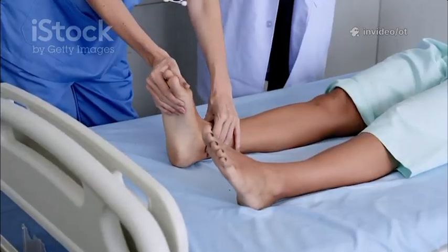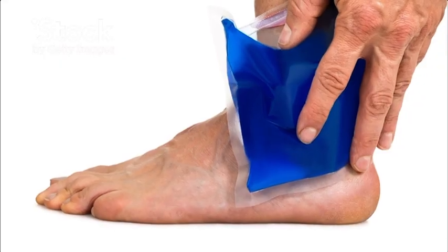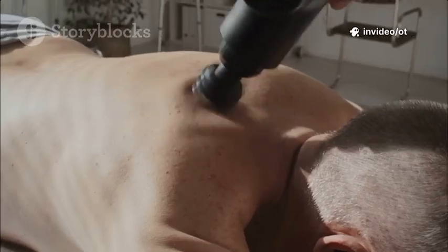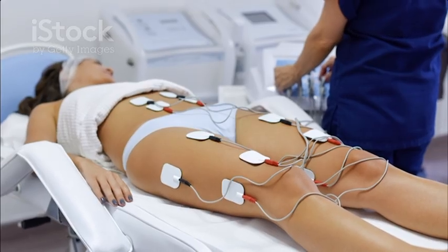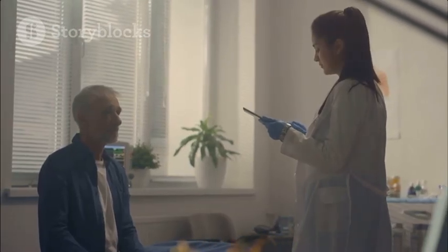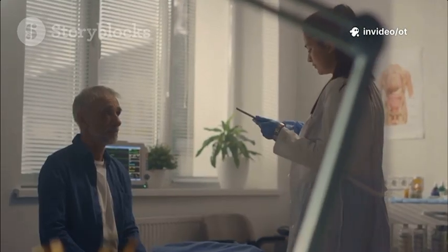Electrical stimulation, or E-Stim, uses electrical currents to elicit physiological responses in nerve or muscle. The response depends on current type and parameters. TENS, mainly for pain control. NMES, for muscle contraction and re-education. IFC, often for deeper pain modulation. TENS blocks pain via gate control or triggers endogenous opioid release. NMES depolarizes motor nerves to produce visible contraction for strengthening, reducing atrophy, and improving motor control.